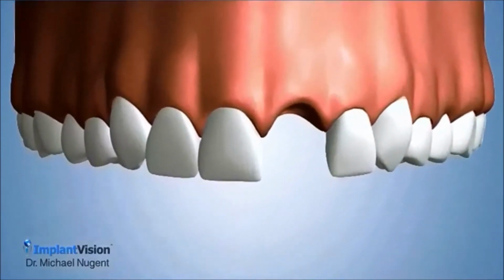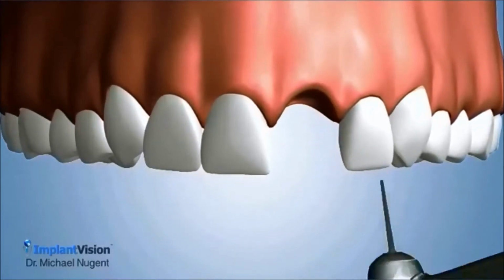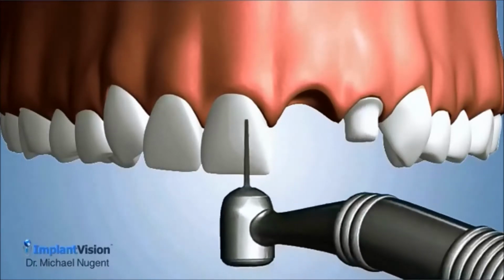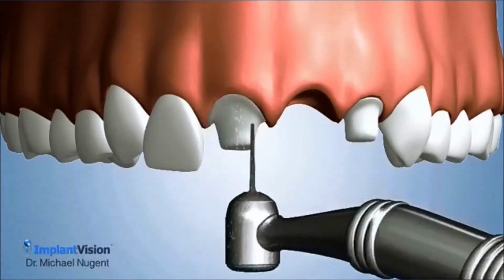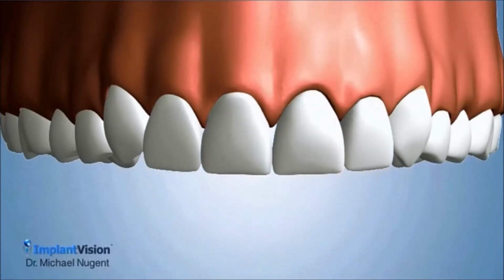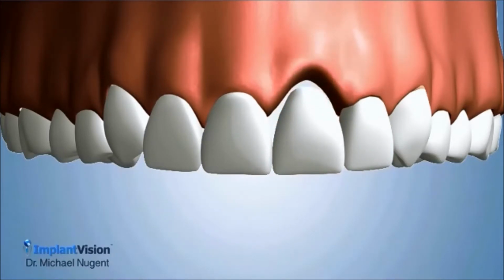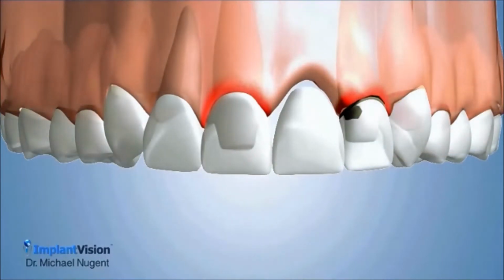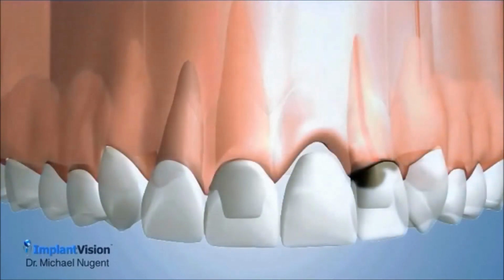The third option is referred to as a fixed bridge. A high-speed drill shaves down a significant amount of the neighboring teeth's natural structure. This prepares the teeth for the fitting of a fabricated 3-unit bridge that is cemented in place. However, bone loss soon occurs, and plaque buildup is common below the margins of the crowns. The neighboring teeth lack adequate tooth structure, which makes them weaker and more susceptible to tooth decay.